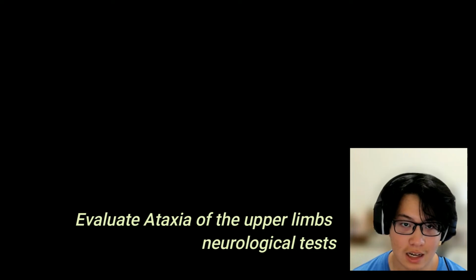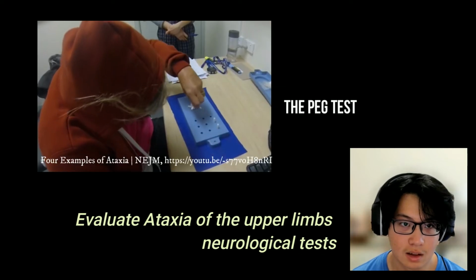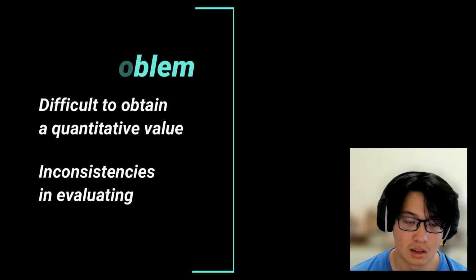In order to evaluate ataxia of the upper limbs, neurological tests include the finger-to-finger test, the finger-to-nose test, and the peg test. The problem with these tests is that it is difficult to obtain a quantitative value, and as a result, leads to inconsistencies in evaluating the patient's condition and treatment effectiveness.